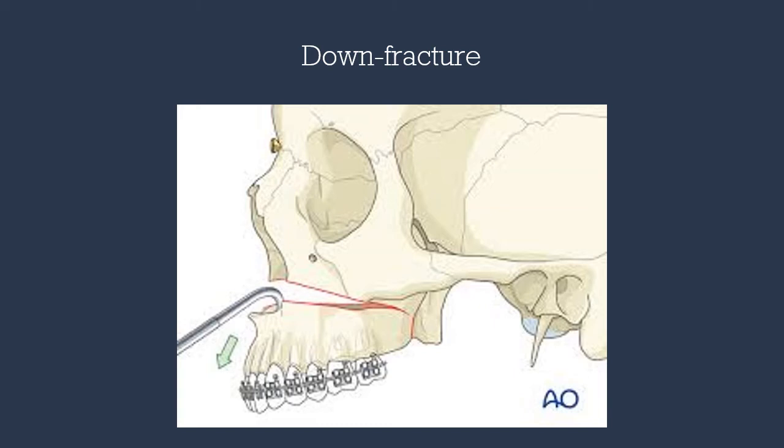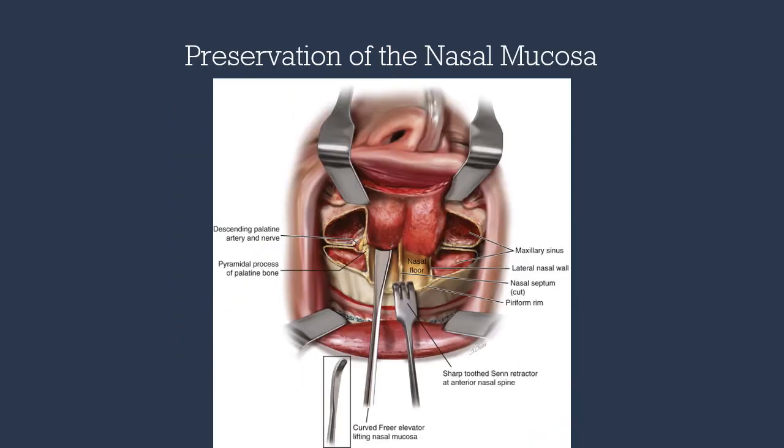With the J-hook over the nasal spine, we apply very gentle force inferiorly to down-fracture the maxilla. While down-fracturing, we use the freer elevator and Frazier tip to slowly dissect the nasal mucosa to avoid any tears. At this point, we can also place Ray-Tec gauze on either side of the maxilla to decrease bleeding.